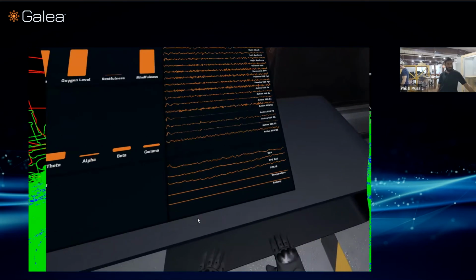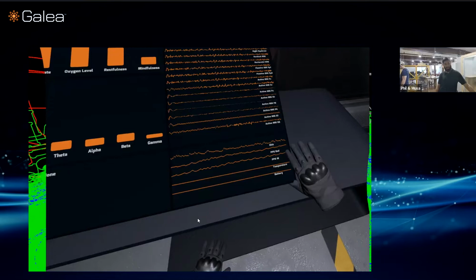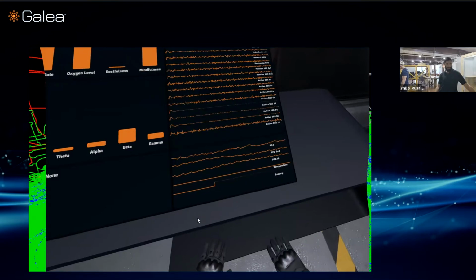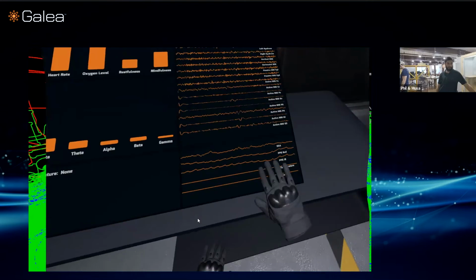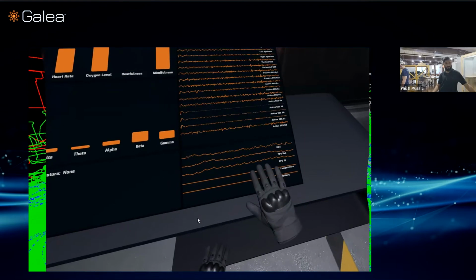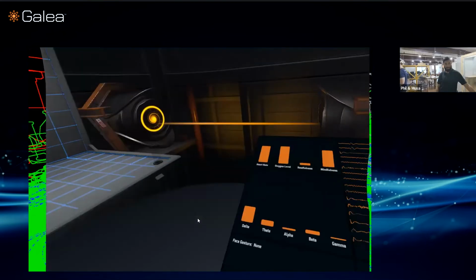So below electrodermal activity, we have photoplethysmography, which is where we shine two lights, two LEDs in the red and IR spectrum at the skin. And as fresh blood is pumped through your veins, you see these peaks in the PPG signal. And if you can detect these peaks, you can easily gather the heart rate. So the challenge is like, can we consistently measure these peaks? And that will give us the heart rate, as you can see on the top left.